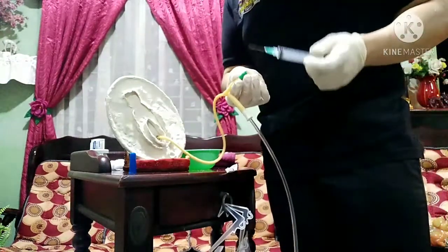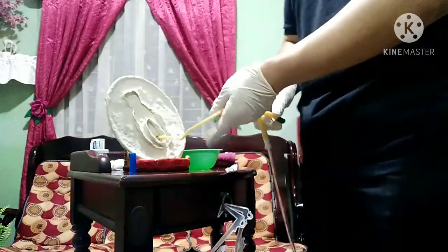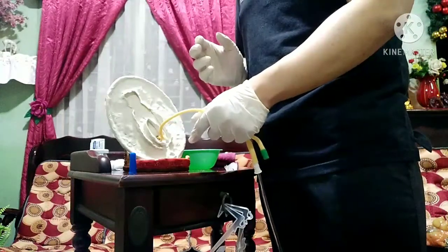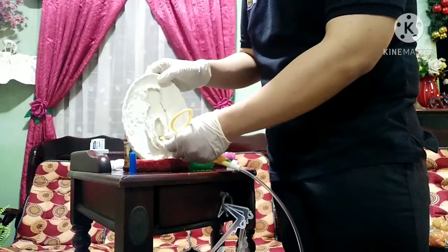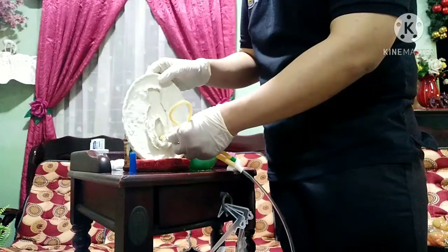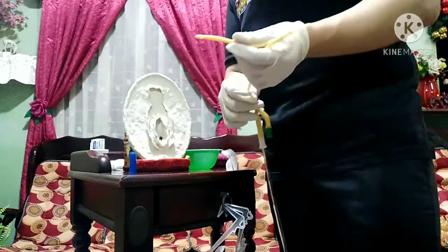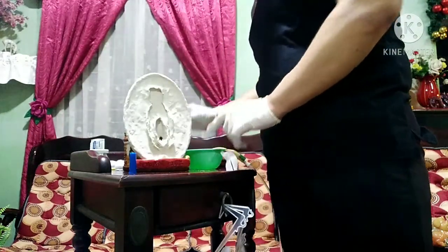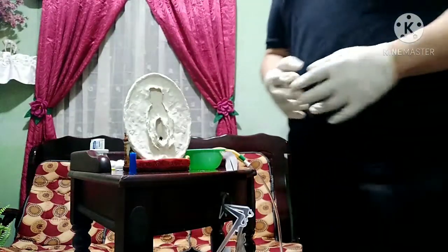So, kapag na-empty na po natin, so, pinch off and gently pull on the catheter near the point where it exits from the meatus po. So, gently na po natin siyang aalisin po. Dahan-dahan lang. Gently. So, ayan po. So, naalis na po natin. So, step number 8 po is clean the perineum.